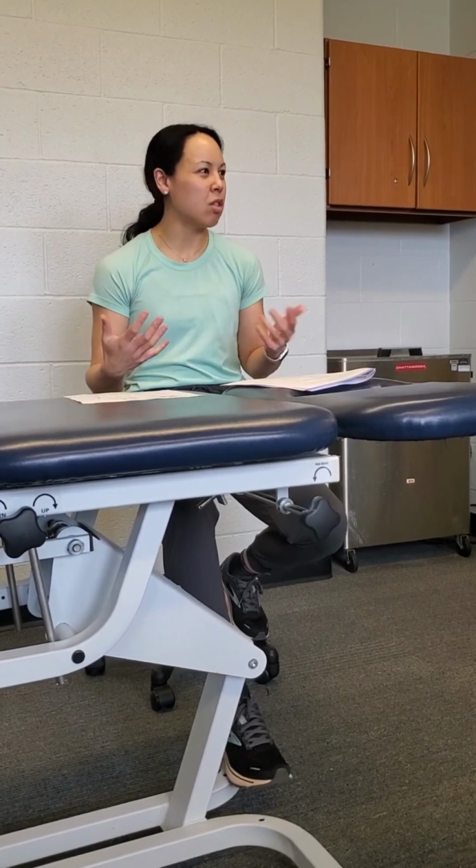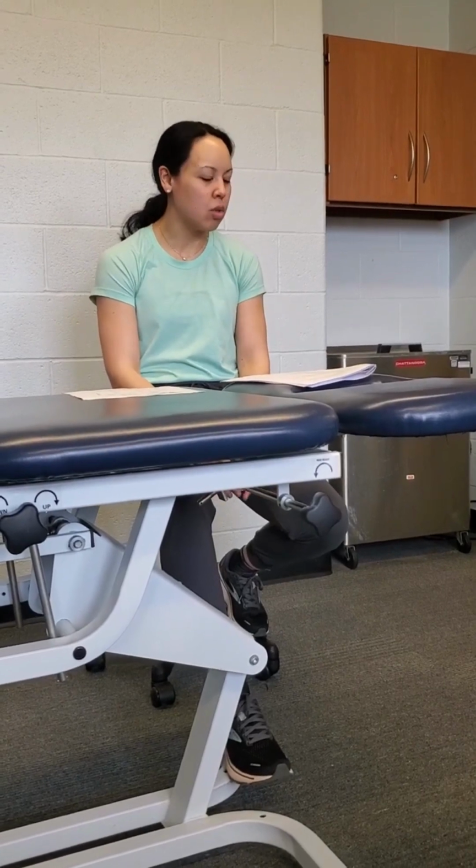because sometimes the patient is kind of cold when they're coming in. You almost want to do a little bit of a warm-up, they could even do a 10-minute warm-up on the bike, and then come over, have them lie down, and then hit the button.